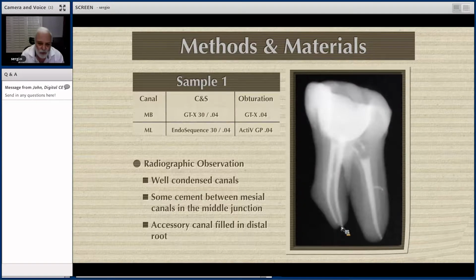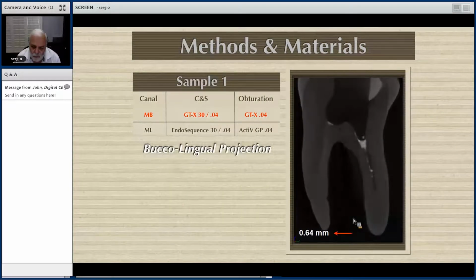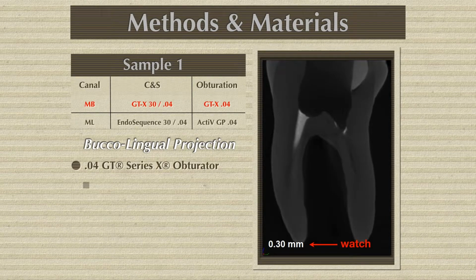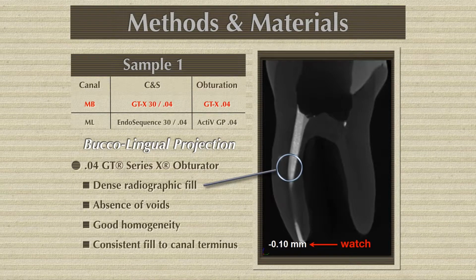Let me show you now this with the micro CT. And we are going from buccal to lingual. These are the sections. This is the GTX, and look at the adaptation of the gutta-percha point. Zero voids. There are no voids whatsoever. Very good homogeneity. It's a constant fill all the way to the terminus.